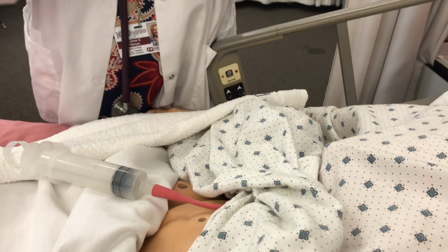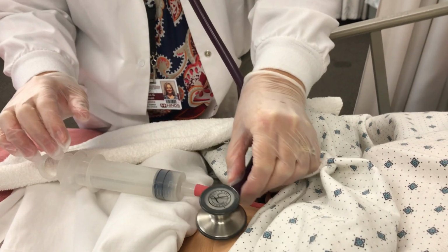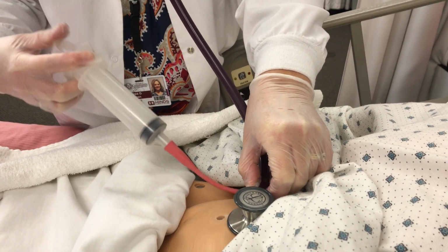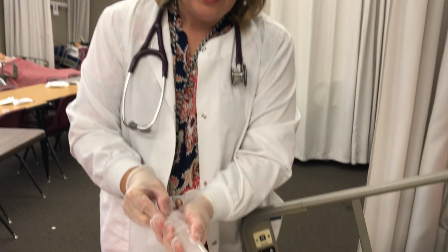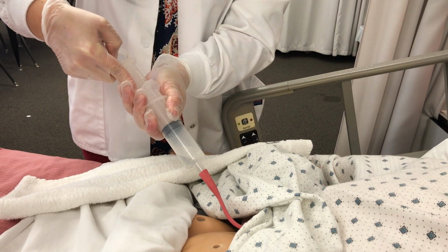And then you can hold that there, and then now I'm going to attach, put my stethoscope in and push the air in and listen for a swooshing sound, and I did hear that. At this point, we need to check for any residual that the client may have. So aspirate until you don't have any more residual, and actually this client does have some residual that's coming.